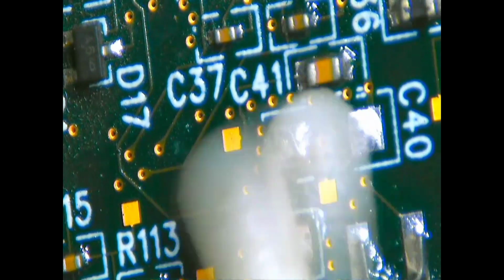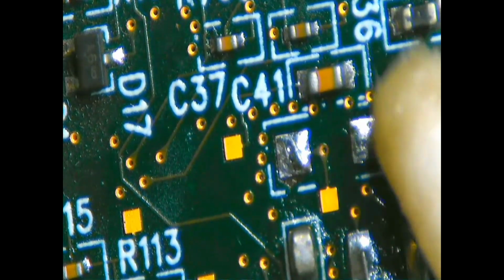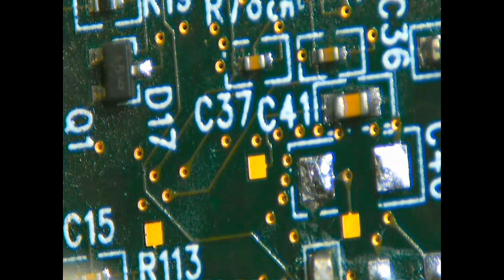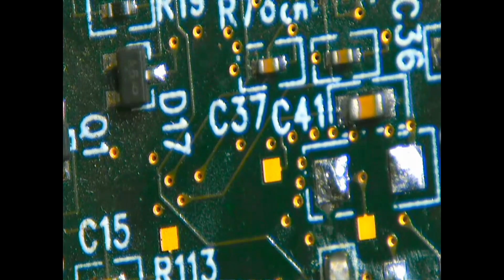So this is the thing. Whenever you are playing with SMDs, you should know where and how to find the problems, and you have to use your inner experience to find which place to start and which place to end. In this video I had a doubt about that capacitor because of its color and some other things. So I just removed that cap, and now the half short is gone. So hopefully it will work after replacing this capacitor.